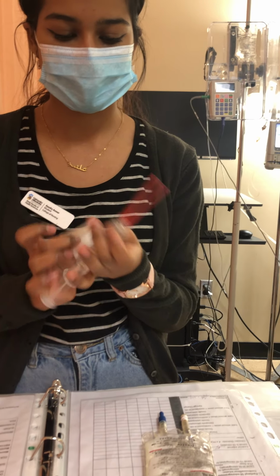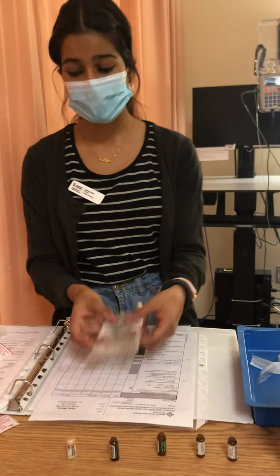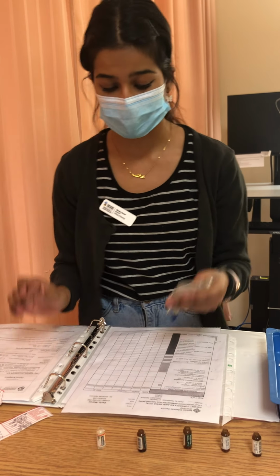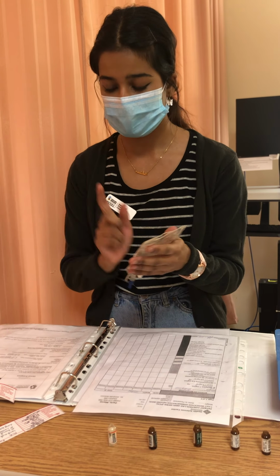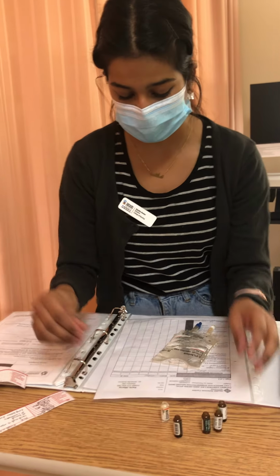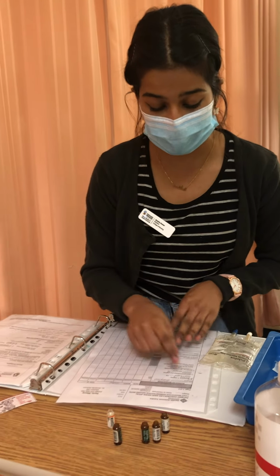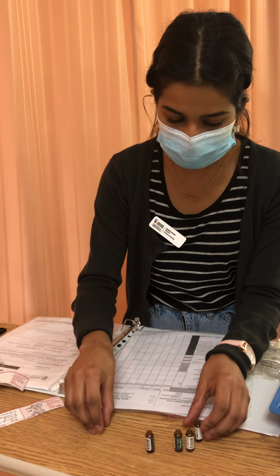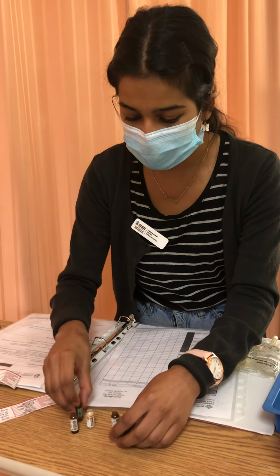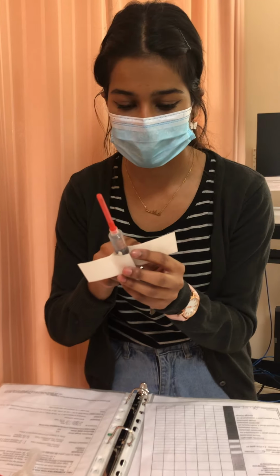I've attached my label. Okay, so now I'm ready to do my second check, and then I'll ensure that a nurse does an independent check with me to make sure that I have the right medication. So my second check is with the MAR, PDM, my drawn medication, my vials, and my mini bag, as well as my labels. So we have right patient, Marcy Paris, right order, or right medication, morphine, and I have a PDM for morphine, and I have morphine drawn up in here as well, 5 mils morphine.